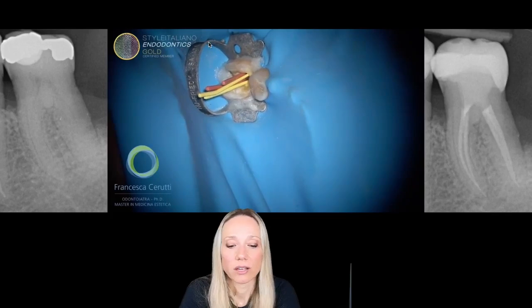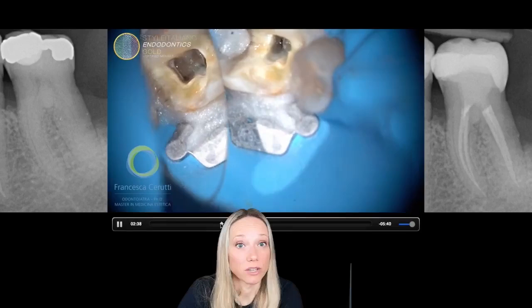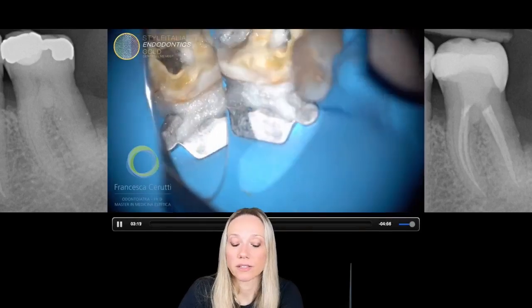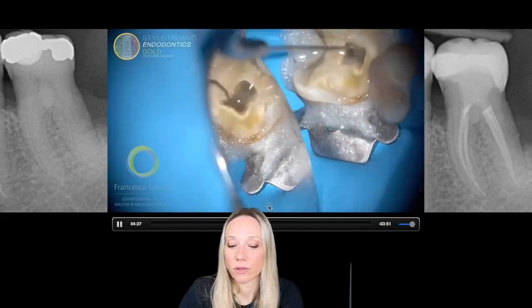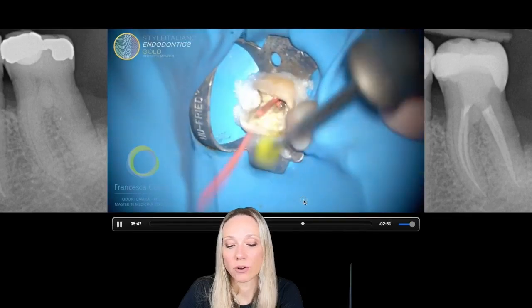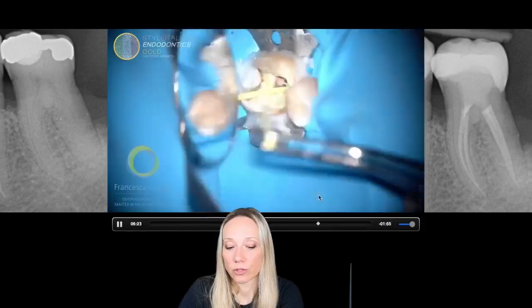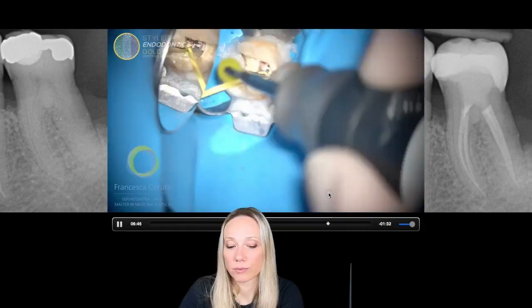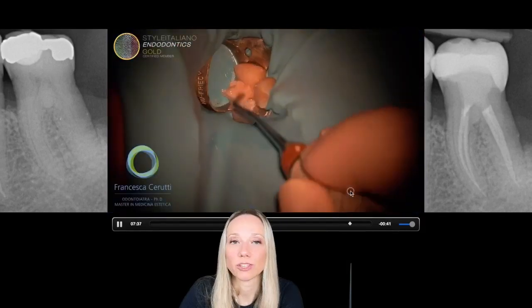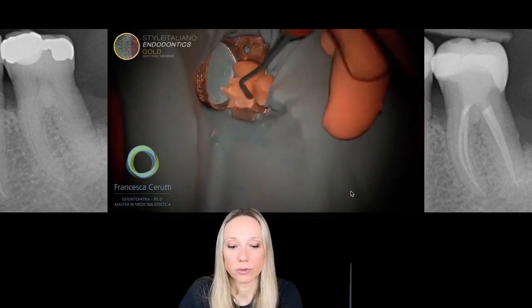I just check the fit of my gutta-percha points. I do my final irrigation protocol. I'm going quick. I activate. I use a hydraulic sealer. I just pack my gutta-percha points. And I do immediately the post-endo build-up. Why? Because I want to make an overlay in this tooth.